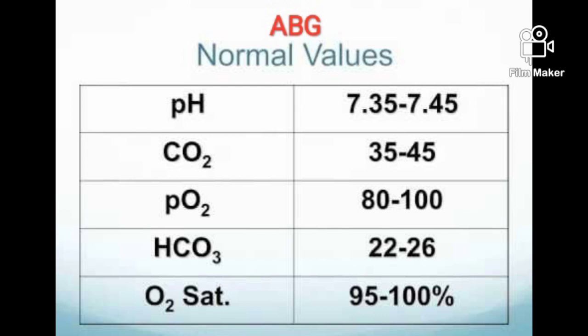If the disorder is metabolic alkalosis, the expected compensation is valued by the increase in carbon dioxide tension is equal to 40 plus 0.6 times the difference in bicarb. If the observed compensation is not the expected compensation, it's likely that more than one acid-base disorder is present.